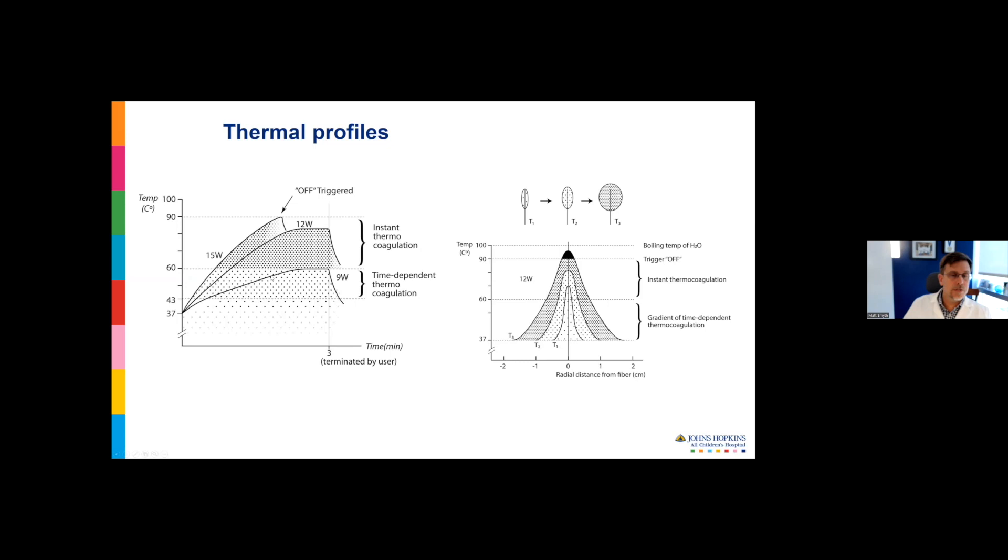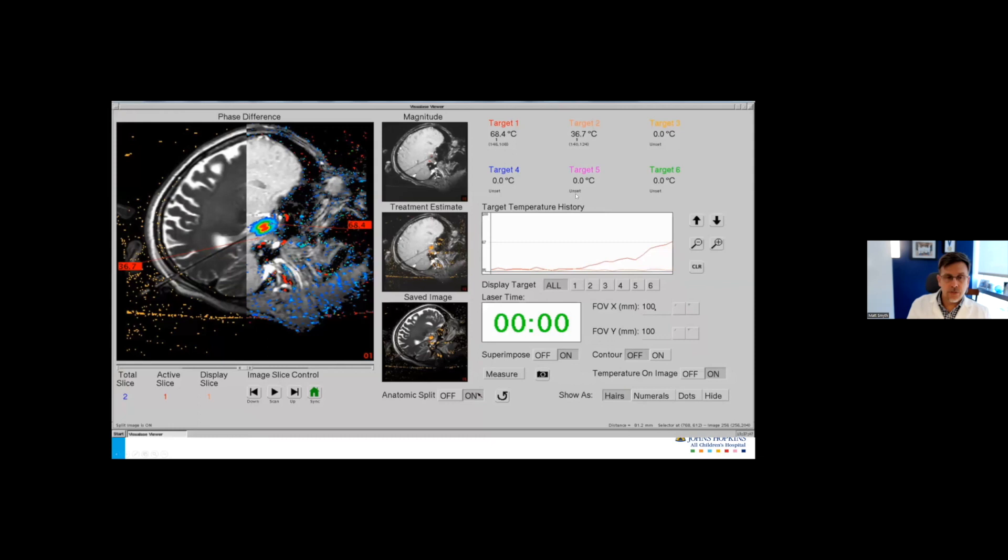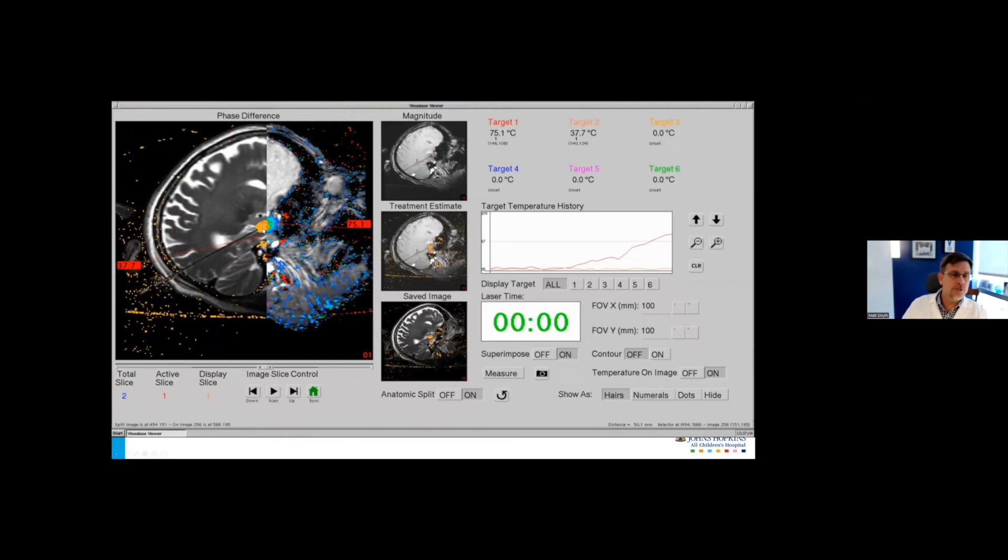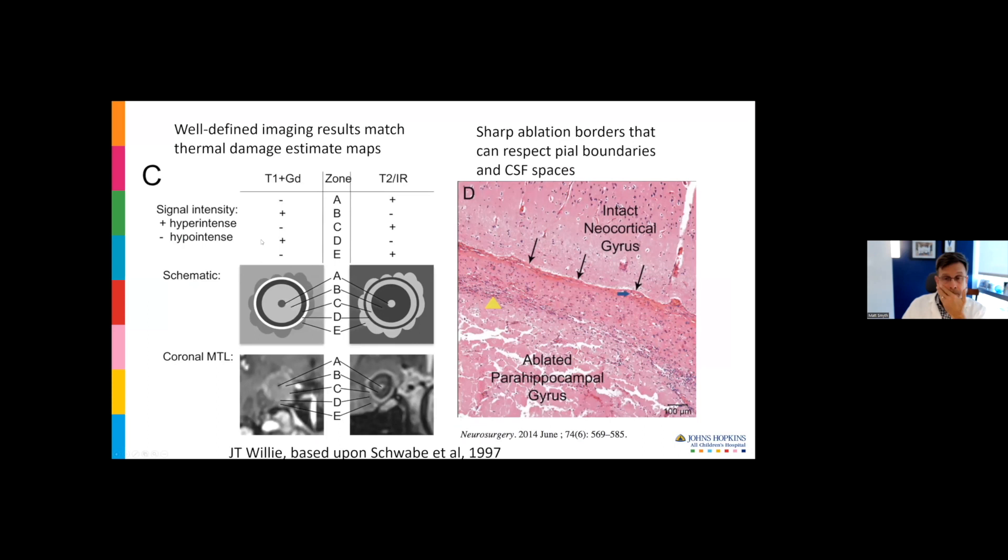Here's a screenshot from a Visualase case. You can pull this slider across to see your thermal damage estimate. One of the nice things about laser ablation is your post MRI imaging—your zone demarcating thermocoagulation and necrosis is fairly well defined. It correlates nicely with the ring of enhancement with gadolinium. On histopathology, you see a pretty sharp border for the thermocoagulation. It also tends to respect pial boundaries and CSF spaces.